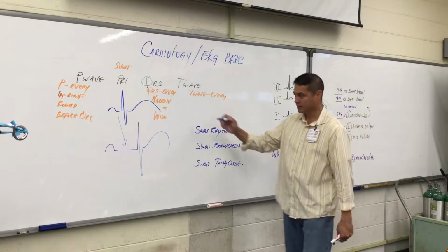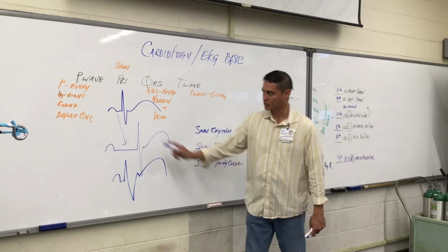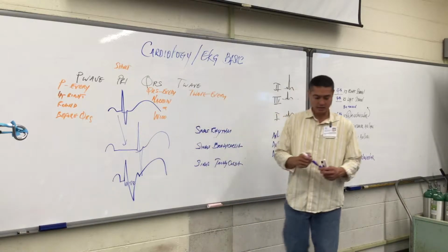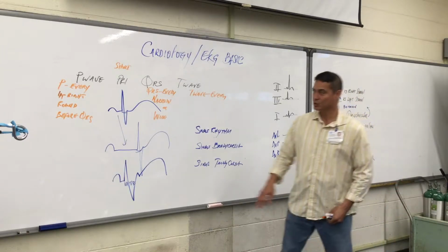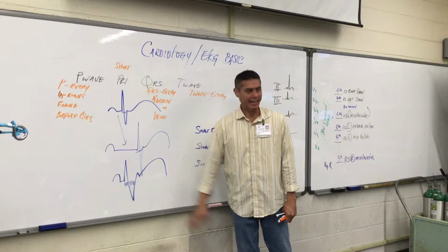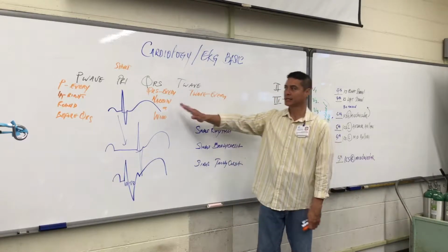Well, I'm going to dramatize this again. And all it did was, this space in between this QRS now is wide. You see how wide it is? And when you look at those EKG tracings, as we start to see them on real patients, you're going to notice that usually it's really fine. It's like two needle points that kind of went up and down. But when you start to notice, I can see the separation between the two of those, then you would consider, I wonder if that's wide. Now, does that matter? Not really.